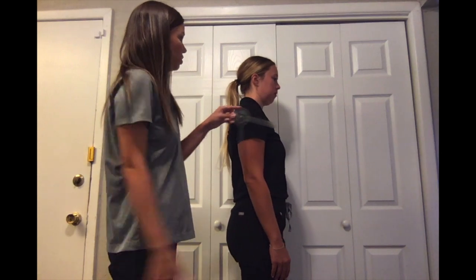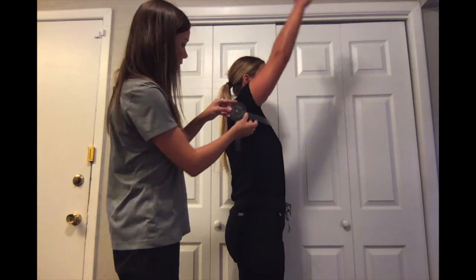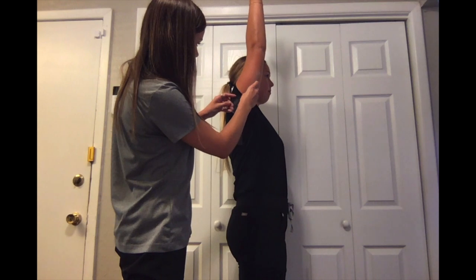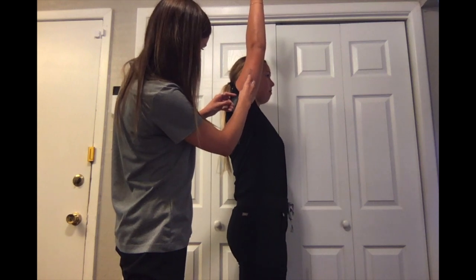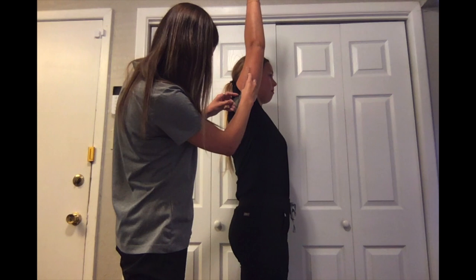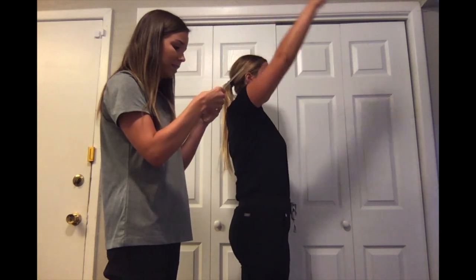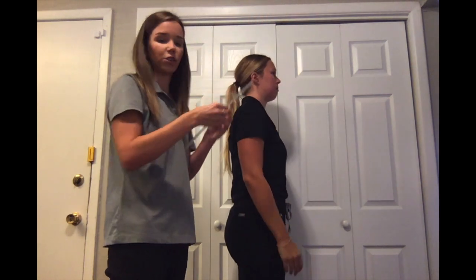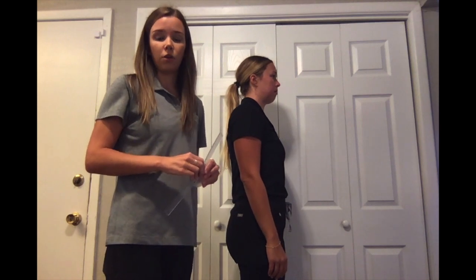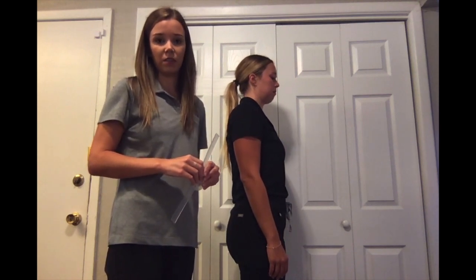Addison, I want you to raise your arm up as high as you can for me. Can you give me any more? Addison is at 170 degrees of shoulder flexion. The normal range of motion for shoulder flexion is 170 degrees.